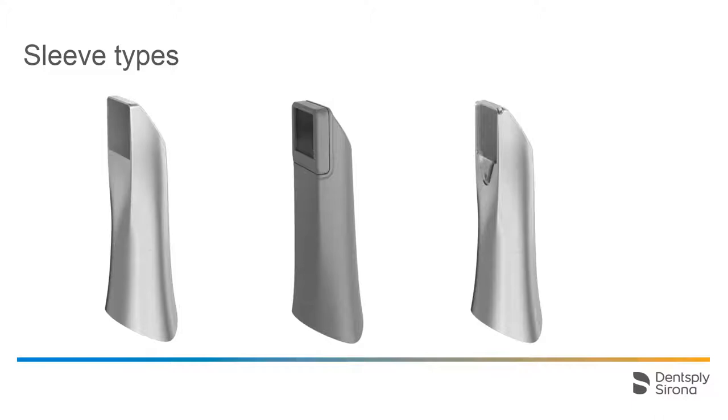There are three different types of sleeves in total. On the left you can see the stainless steel sleeve with sapphire glass. In the middle is the disposable sleeve that is discarded after each patient use. And on the right we have the autoclavable sleeve with a disposable window.